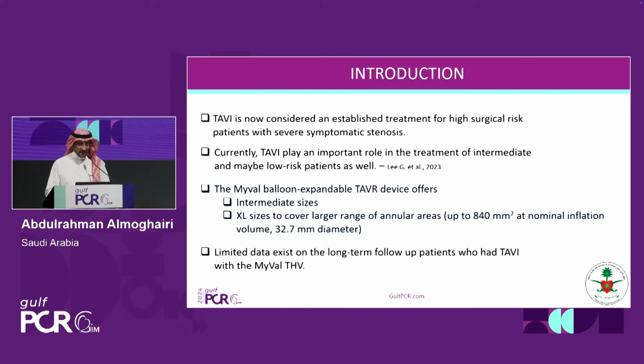So transcatheter valve therapy for the aortic valve is a well-established therapy. Currently many platforms have successful short and relatively long-term results, up to 10 years. It's gaining more weight with the evidence over time and more platforms ongoing. Now we are discussing the long-term or lifelong management, moving more towards the short frames more than long frames. For the future expectations, the Myval is unique in having the intermediate and extra-large sizes among the balloon expandable valves, until the competitors come with this on board, with a continuously successful journey.